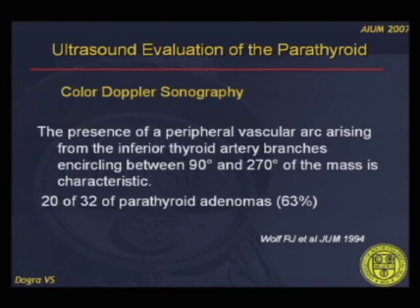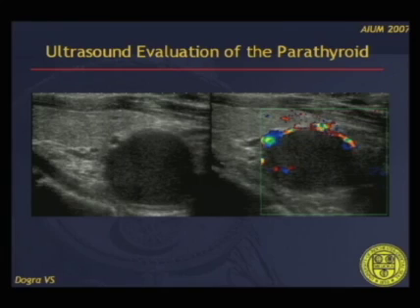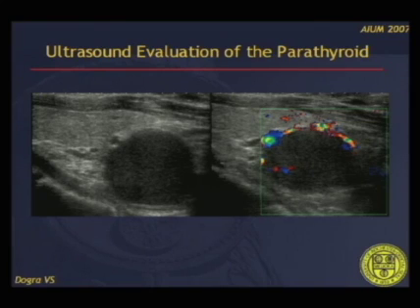In a study by Wolf, Hall, published in JUM in 1994, they described the presence of an arc between 90 and 270 degrees around the parathyroid mass, seen in 20 of 32 patients. This is an example demonstrating the peripheral arc — the first image is a grayscale of a hypoechoic mass confirmed as parathyroid adenoma, with color flow Doppler demonstrating the arc sign.